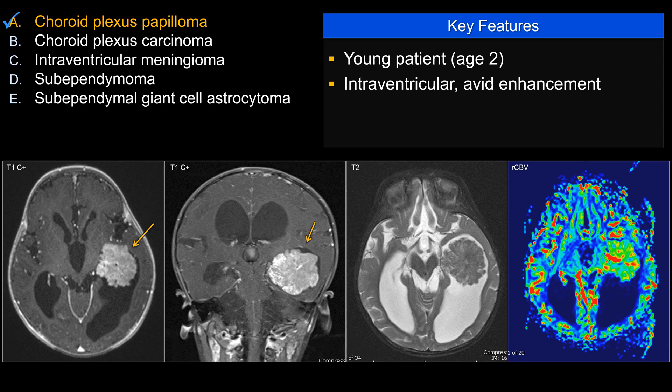There is a large intraventricular lesion with avid enhancement. The pattern of enhancement is relatively homogeneous. There is also moderate hydrocephalus. Notice that the lesion is not in a location that can obstruct — therefore, the hydrocephalus is likely coming from CSF overproduction, which is what choroid plexus papilloma can do.